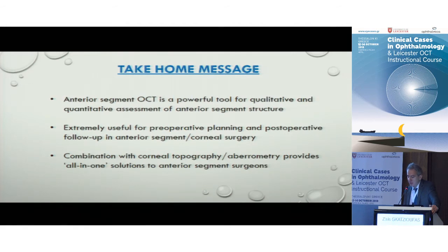And nowadays we have all-in-one solutions, devices performing the imaging, also corneal topography, aberrometry, and soon biomechanical analysis of the cornea. And this is actually something that all anterior segment surgeons are welcoming in their everyday practice.